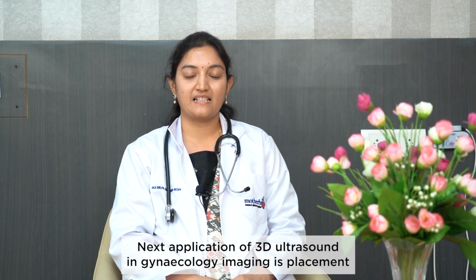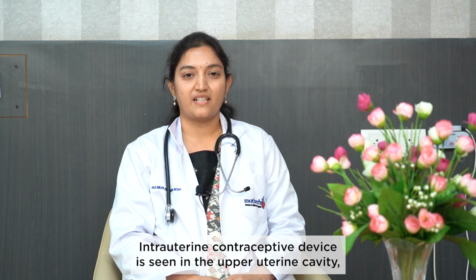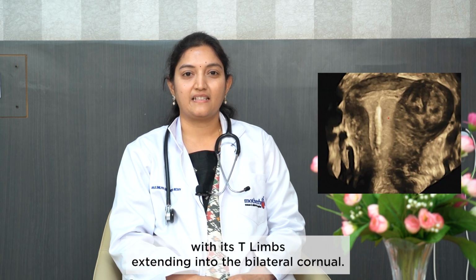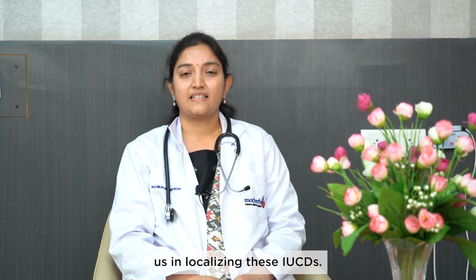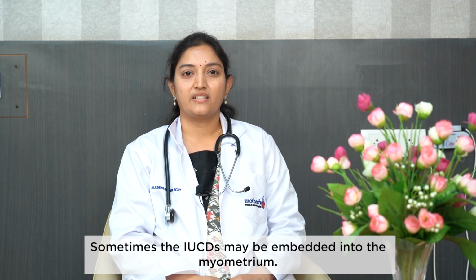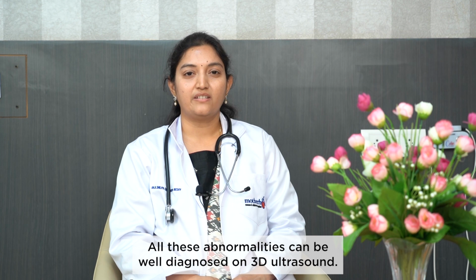The next application of 3D ultrasound in gynecology imaging is placement and localization of intrauterine contraceptive devices. A normal intrauterine contraceptive device is seen in the upper uterine cavity with its T limbs extending into the bilateral cornua. 3D ultrasound helps us in localizing these IUCDs. Sometimes there will be malpositioning of the IUCDs. Sometimes the IUCDs may be embedded into the myometrium. All these abnormalities can be well diagnosed on 3D ultrasound.